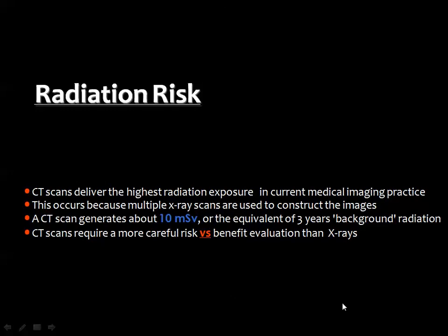Then one of the very important issues here, especially if you are dealing with multi-detector, which is now the only machine in the market. All the spiral CTs are no longer manufactured, and also the incremental CT, the first CT, is no more manufactured. The only available machine here is the multi-detector, which is a machine that has a big radiation risk, especially whenever the number of the detectors is high. Then you should weigh the risk of radiation against the benefits of the patient from this particular machine.